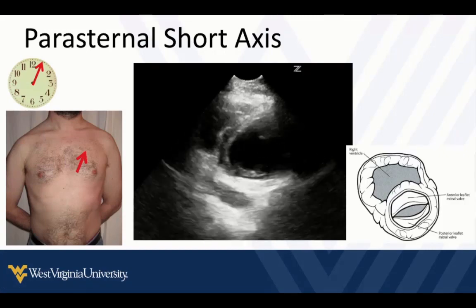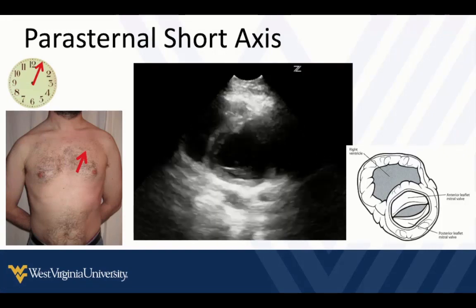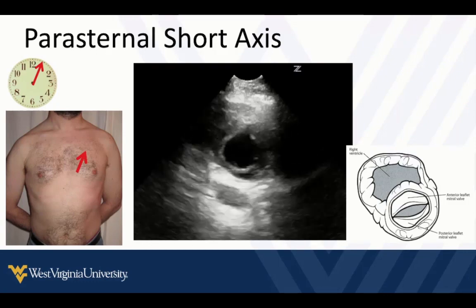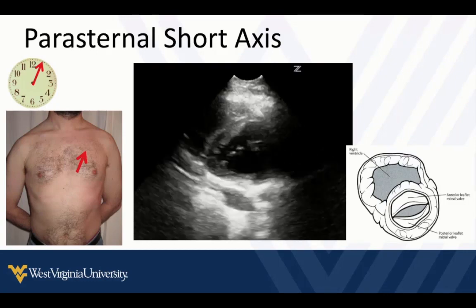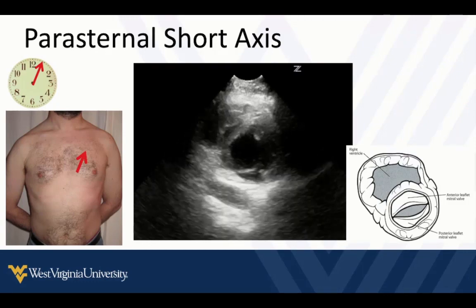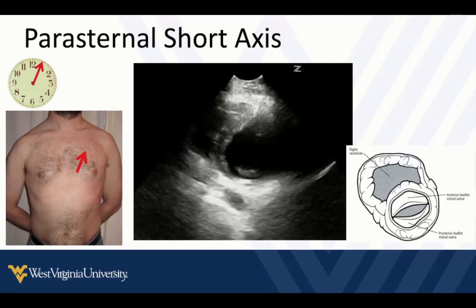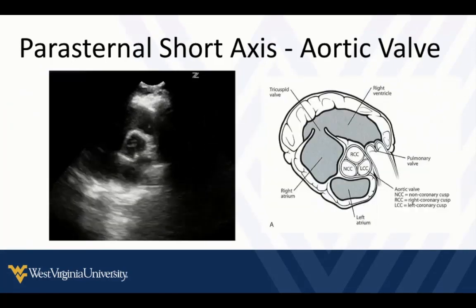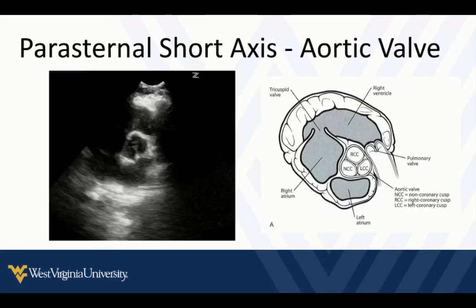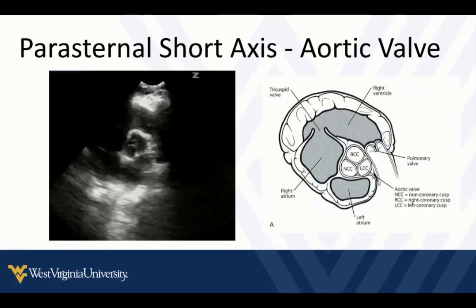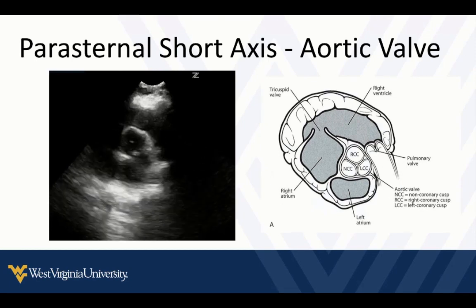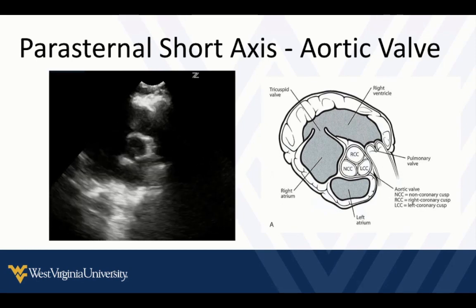We want a perfect cross section. If we rotate too far in one direction or the other, we can cause false positive findings, so I will be nitpicky on that point. We can take different slices — a little closer to the sternum or farther away — to image different structures.